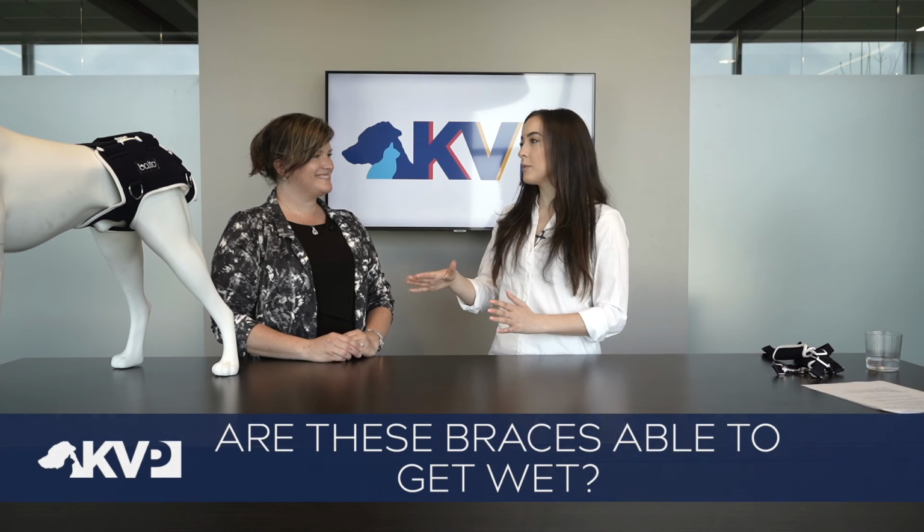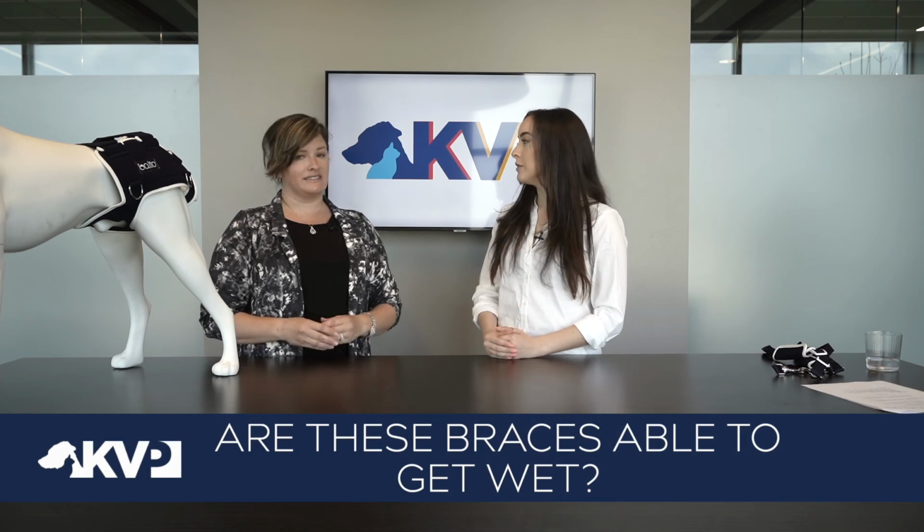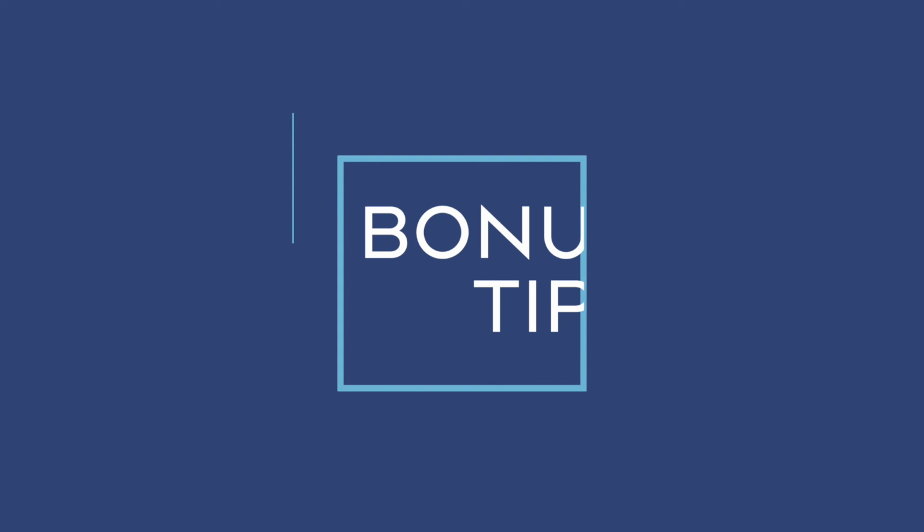Are these braces able to get wet as well? Yes, so you're fine if you need to take them outside to use the restroom and it's raining. You're just going to hang it up to dry. And then of course, if you need to wash it, you're going to remove the disc from the brace, cold wash, hand wash, and hang to dry.